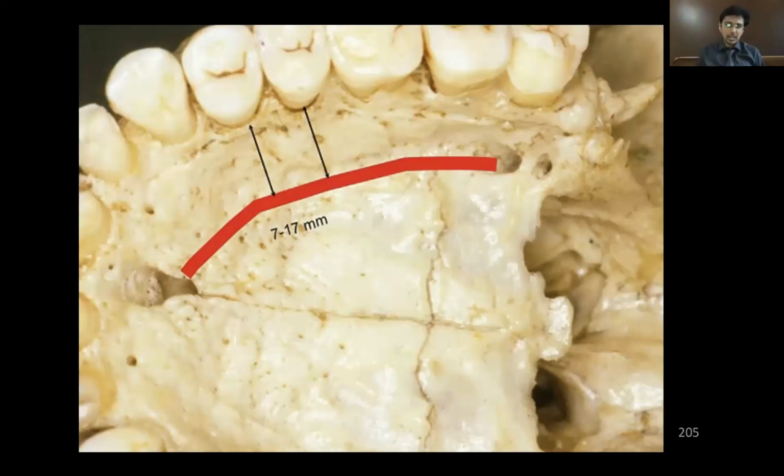In the palatal area, you need to take care of the greater palatine artery. You cannot go too medially, otherwise you will end up injuring the greater palatine artery. You are supposed to take it in the premolar area. Generally, the tissue thickness is more in the premolar area.